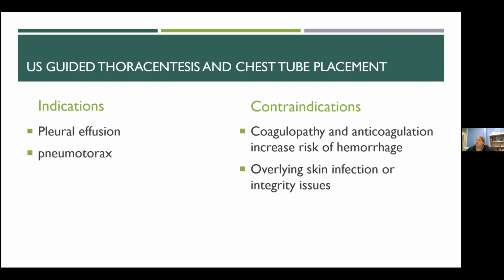Coagulopathy and anticoagulation certainly increase your risk of hemorrhage. I think there are ways to mitigate this with various products and timing of things like platelets or FFP, and again, just being careful about where you are. And we'll talk about how ultrasound can help mitigate that risk. Again, if you have an overlying skin infection or integrity issues, you may need to think about whether there is a better site to do this. But you may also not have a choice of where the right position is for your patient.